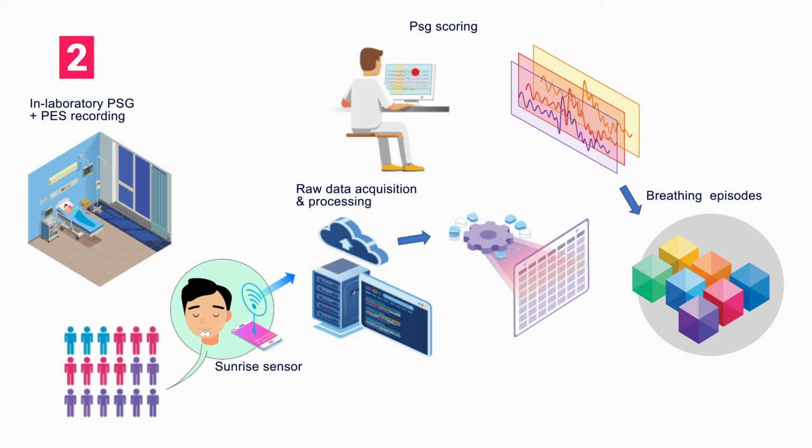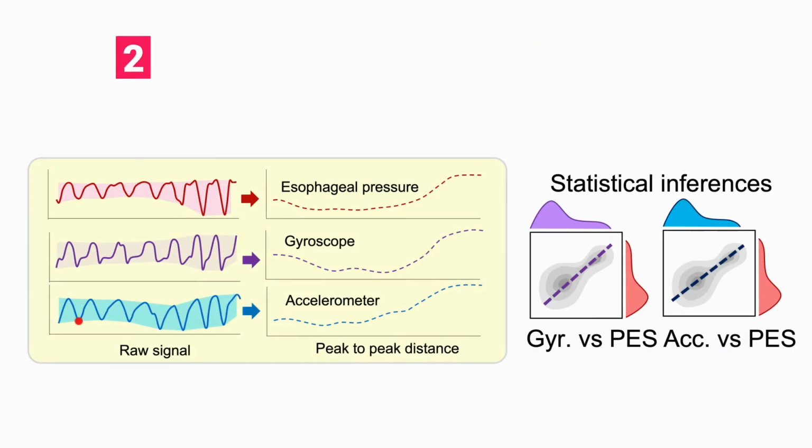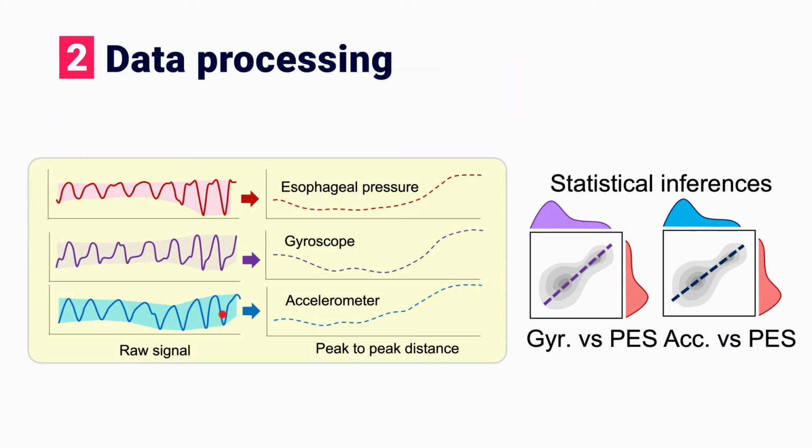Periods of normal and disturbed breathing were scored in the polysomnography blindly to the mandibular signal to collect numerous fragments that were secondly compared to the concomitant timestamps of mandibular movement sequences. An enveloping algorithm was applied to determine the lower and upper bounds of the signal amplitude. Next, peak-to-peak distance, which means the signal amplitude, was calculated, defined as the difference between upper and lower bounds.